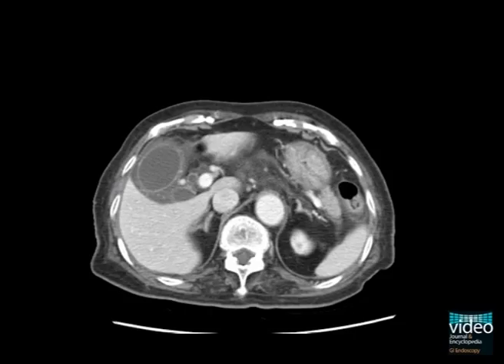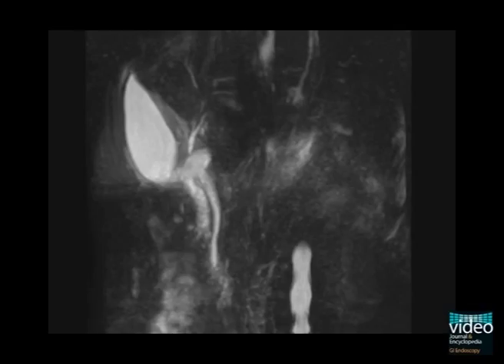Abdomen CT showed a distended gallbladder, wall thickening, and pericholecystic fluid collection. MRCP also shows the same findings with multiple GB stones.